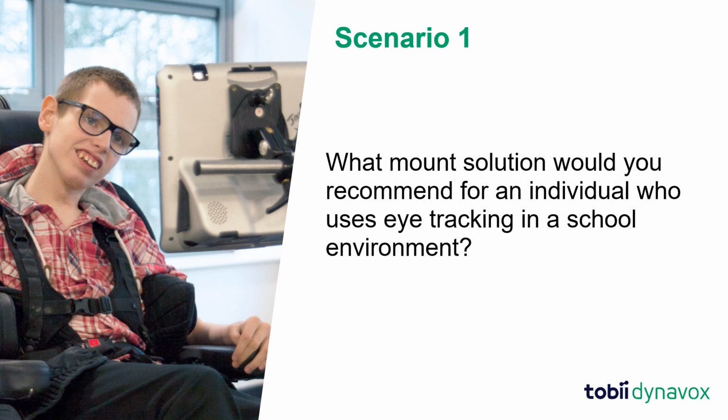One question would be, is the student changing classrooms, or are they in one classroom all day? If they are in a single classroom, a floor mount may be used. If they are changing classrooms often, a more portable table mount may be more efficient. Also consider who will be moving the mount from class to class.